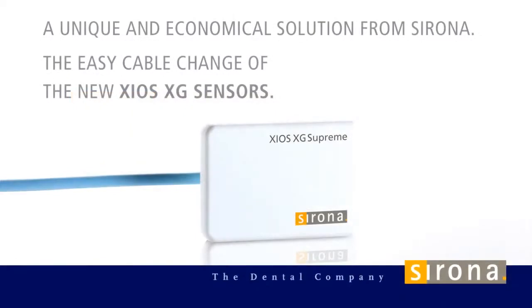A unique and economical solution from Sirona: the easy cable change of the new XIOS XG sensors.